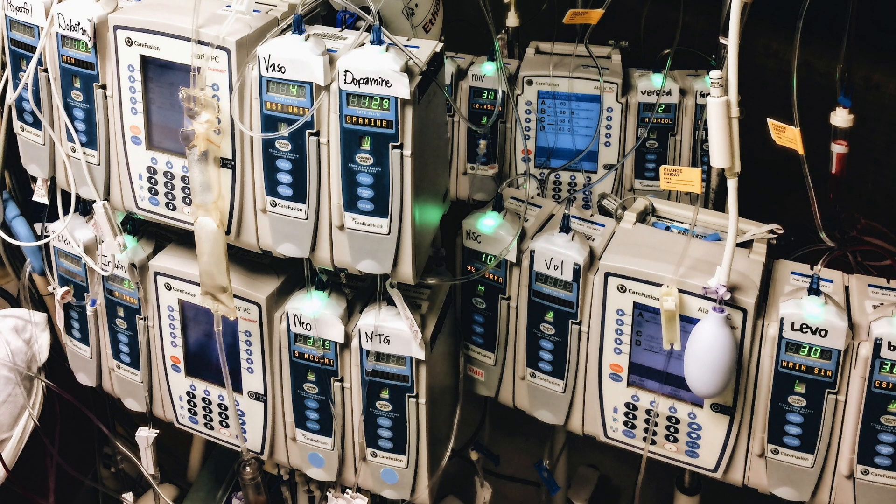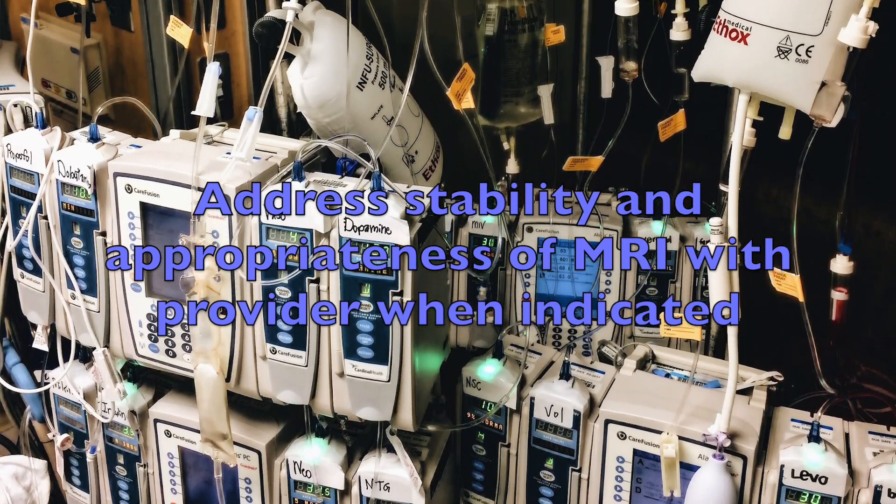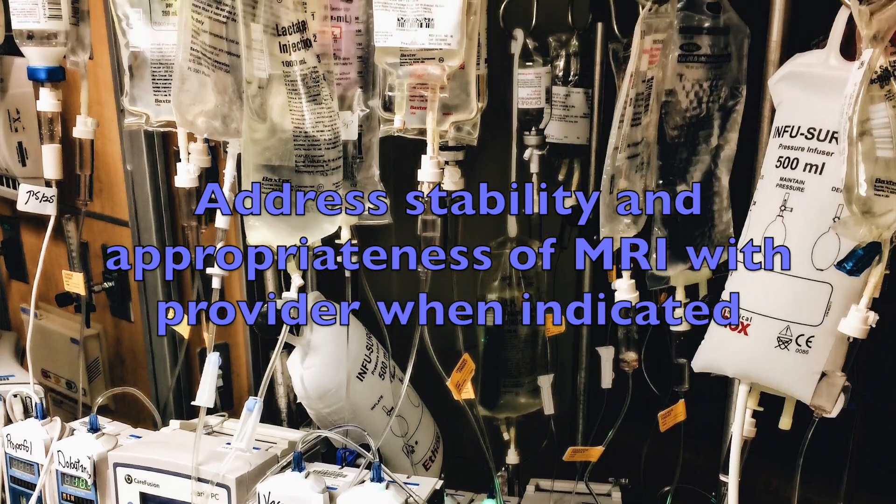If your patient needs an MRI but is on multiple IV infusions, you must first address whether your patient is hemodynamically stable. If you are actively titrating infusions to maintain hemodynamics, the MRI is probably not a priority. Discuss this with the ordering provider.